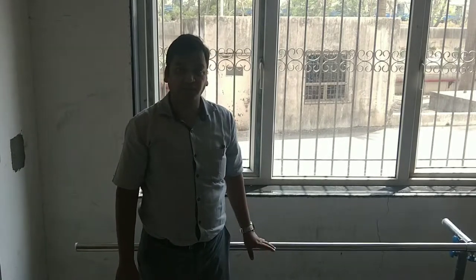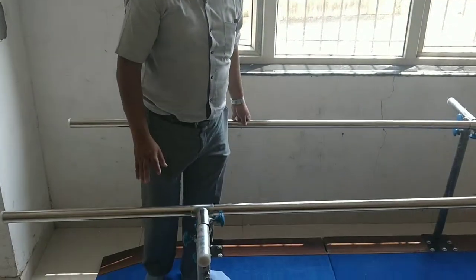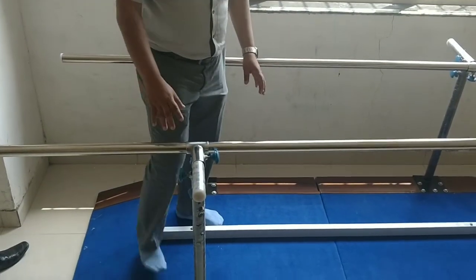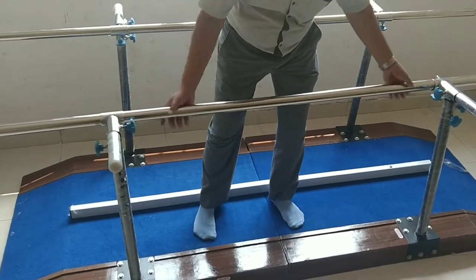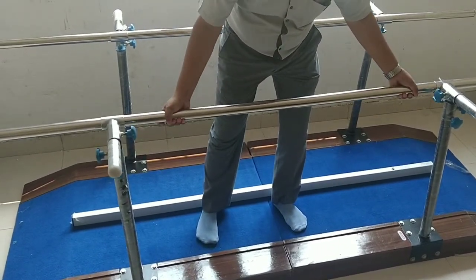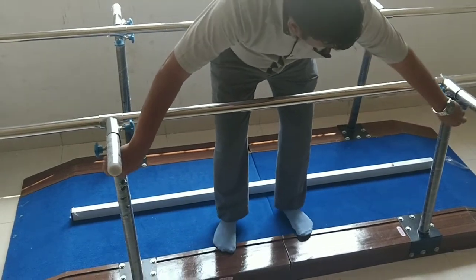This is an ionic parallel bar with base. The features of this table are that the width can be adjusted, as you can see here — the width can be adjusted. The height also can be adjusted.